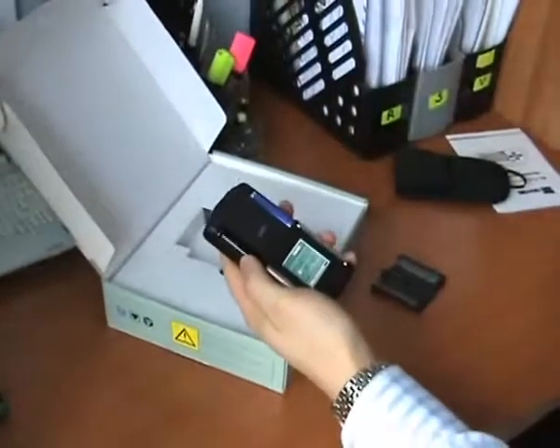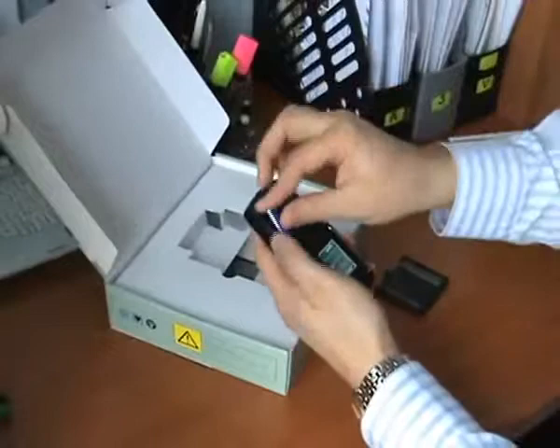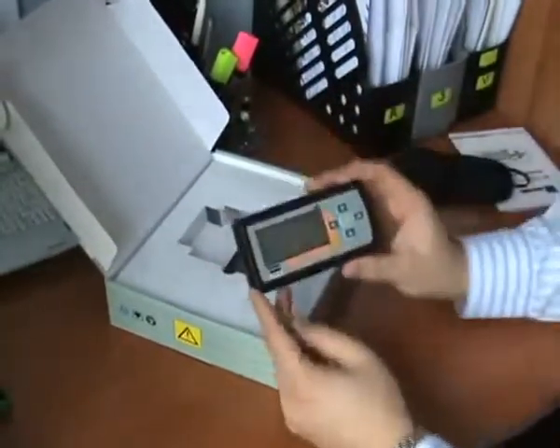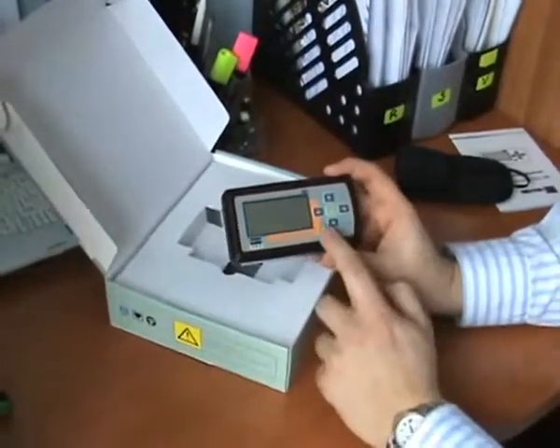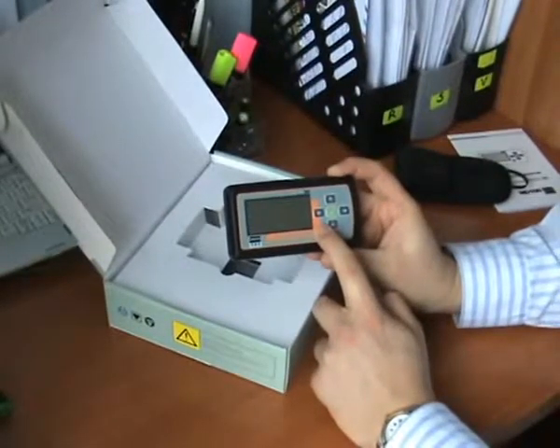First of all, you have to input new batteries. Now everything is OK and ready to be used.